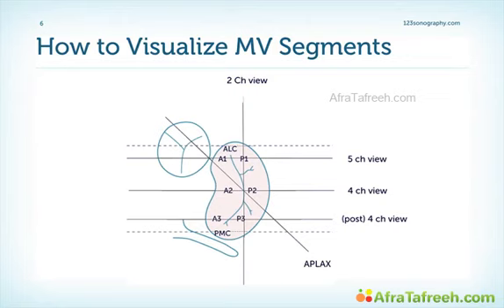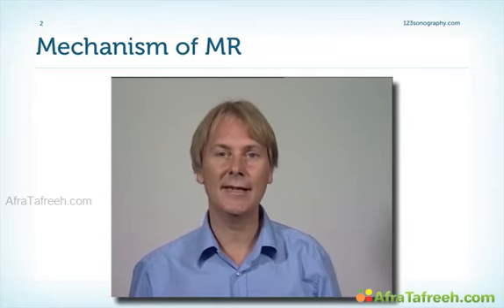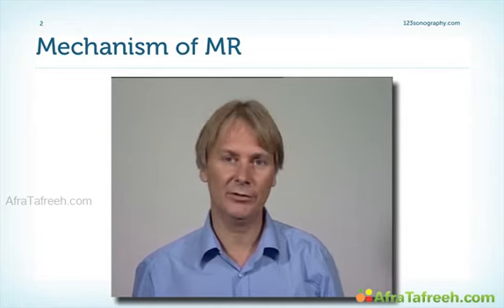the entire valve. Now if you rotate the transducer and we come to the apical long axis view, we will also hit parts of the aorta, and we will hit more the anterolateral parts of the anterior leaflet and more the medial parts of the posterior leaflet. So this is what you will see in the three-chamber view or apical long axis view. The following demo will now show you how we can assess the different scallops from an apical approach.